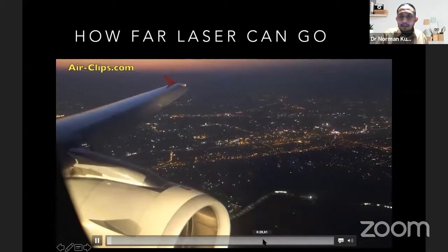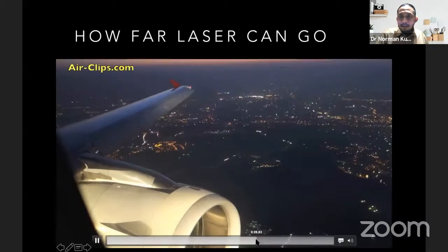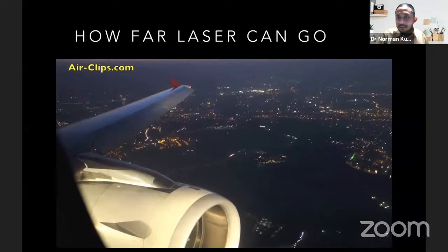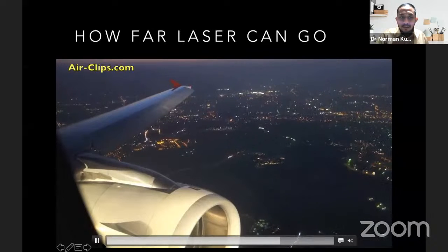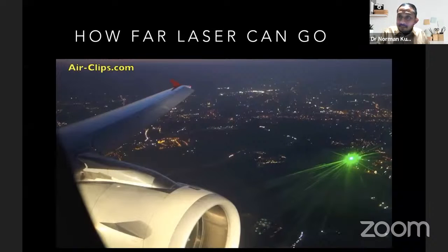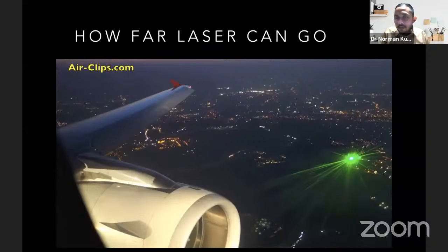As we can see here, the laser wavelength can really travel far, from the surface to the air. The laser can reach through the clouds for more than 400 meters above the ground. From an airplane, the laser can still penetrate through the cabin into the pilot's cockpit. So that is how far a laser can go. How much we can maintain and contain this laser so it can be useful to dentists and patients, we consider the safety.